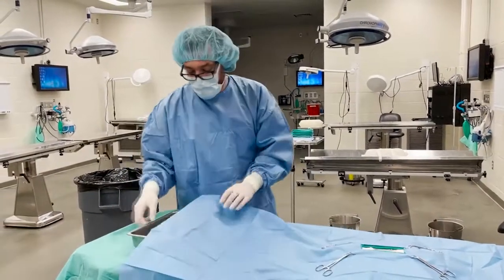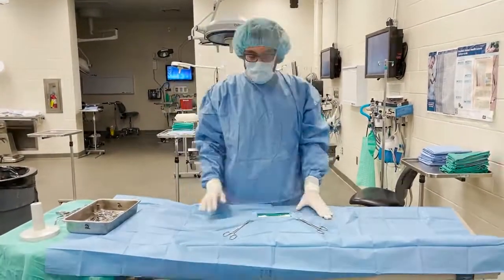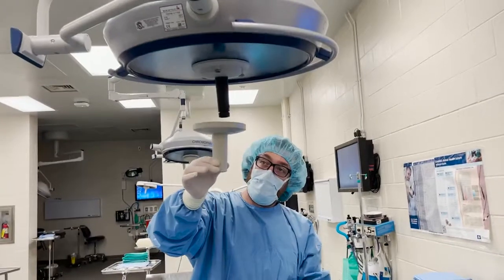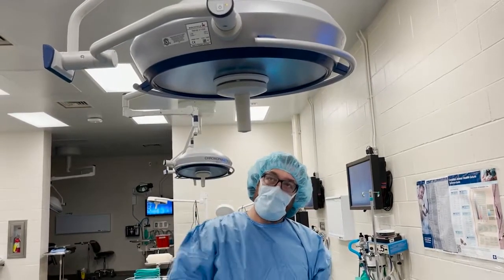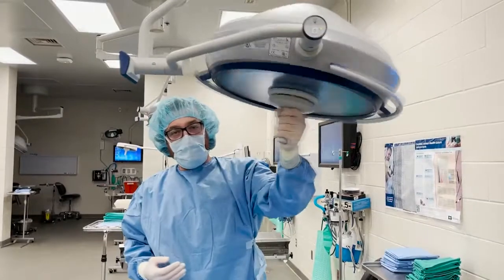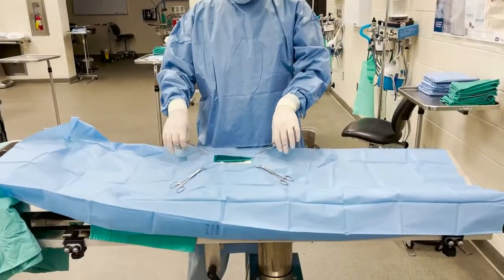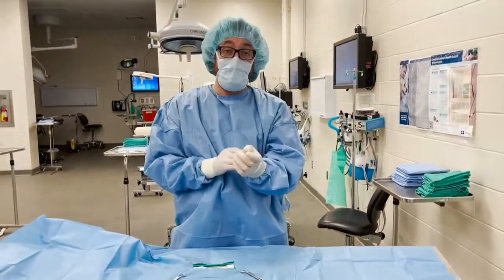You want your table elevated so you can stand fairly tall while doing work — for me, probably about here — which is best for your back. Having that continuous sterile field matters: if the drape isn't secured it's too mobile, instruments can get stuck or drop through. Once your drape is in place, your assistant will bring you a sterile light handle with a button that clicks in. Gently jiggle and push up until it clicks — then you can move the instrument light however you'd like. That's really the only time you'll reach above your head.